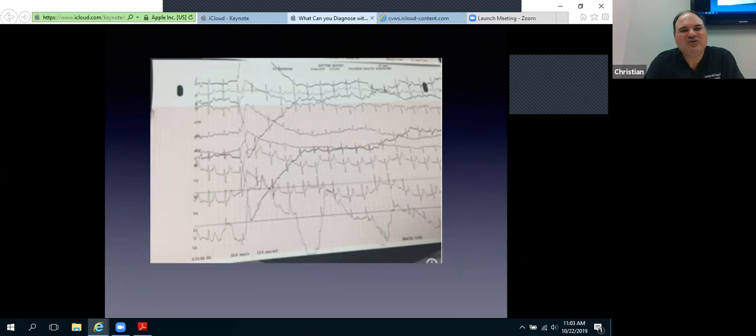This was an EKG I was doing on myself, trying to see if I could do an EKG on myself after I'd been exercising. And I couldn't. And you were panting, panting and breathing. I'm showing this because you get a lot of electrical sway with your respiration. I'm breathing at, per 10 seconds, at least 2, 3, so 24. I'm breathing at a rate of 24 to 30.